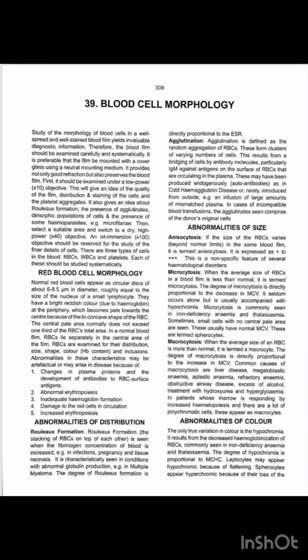Sometimes small cells with no central pallor are seen, and these usually have a normal MCV. They are termed spherocytes.